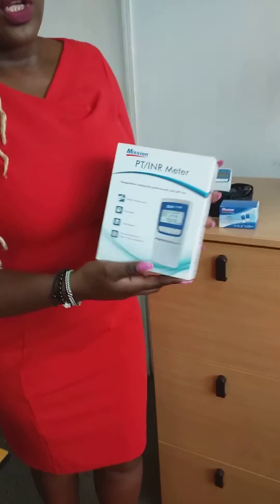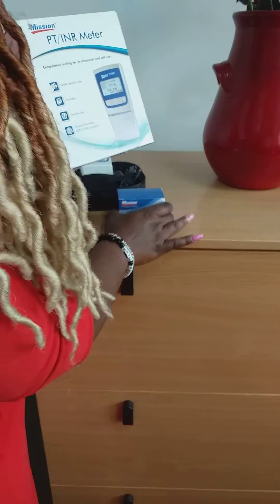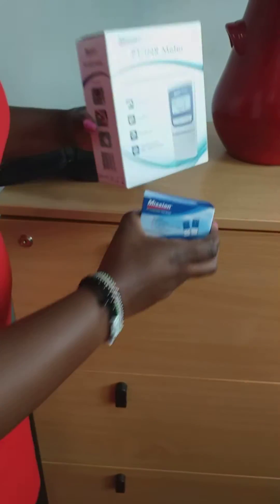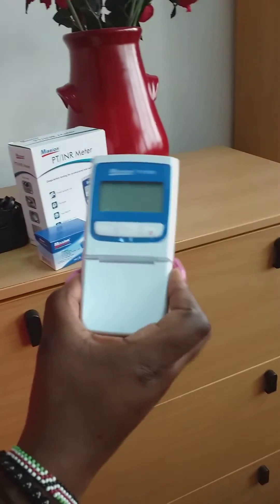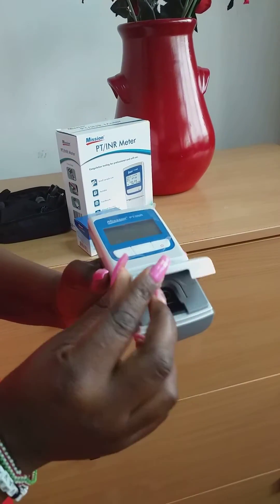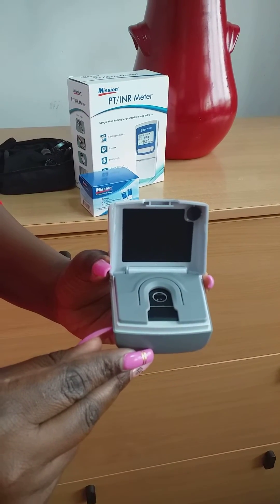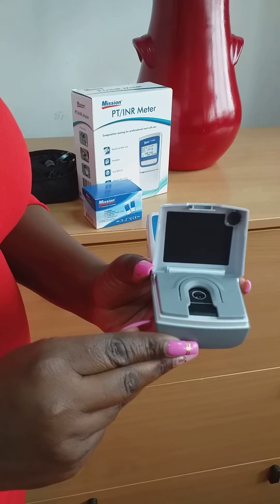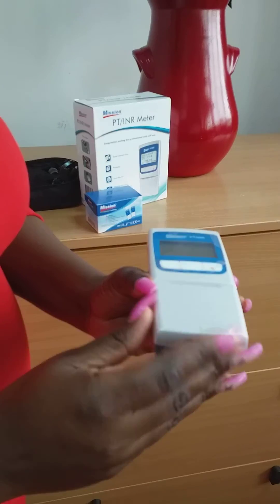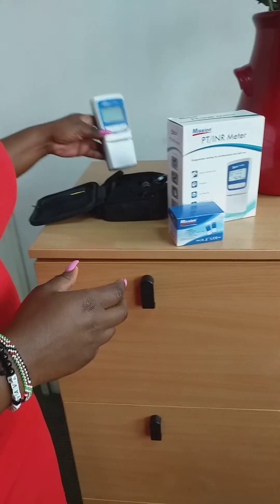We call it the PT INR meter or coagulation meter. As you can see, it comes with a pack of strips. You take your strips and place one strip at a time into this particular slot. You then take a drop of blood equivalent to around 15 microliters, place it right on the strip, close it, and within two minutes you're able to get your results for either PT or INR.